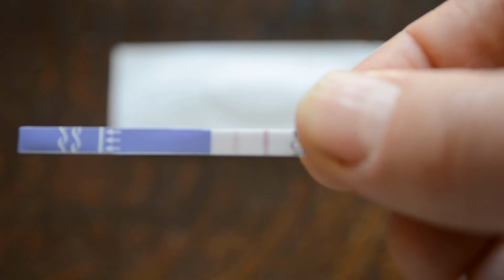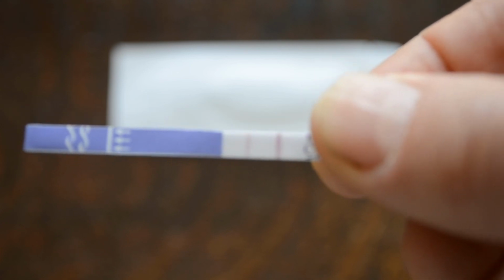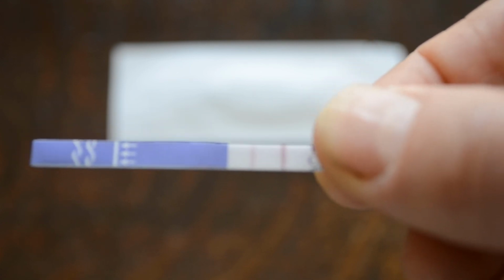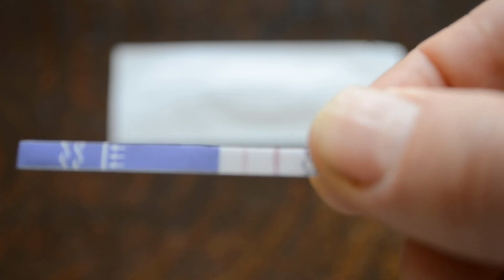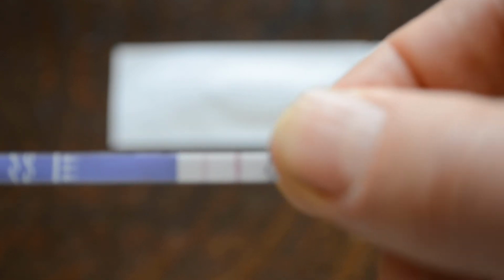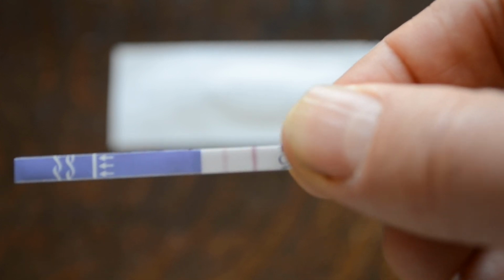And you read the result at the manufacturer's recommended period, which varies slightly from test to test, usually between 8 and 10 minutes. You'd have to give it that long for a positive result to be determined with any specificity. So that's the cocaine urine dip strip test, available from UK Drug Testing.